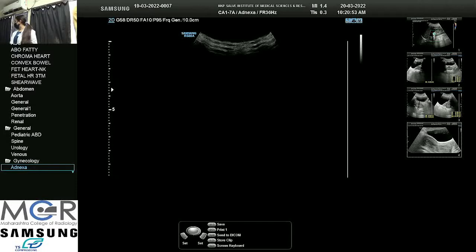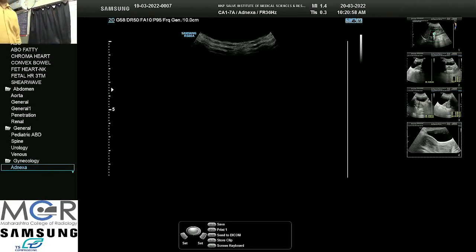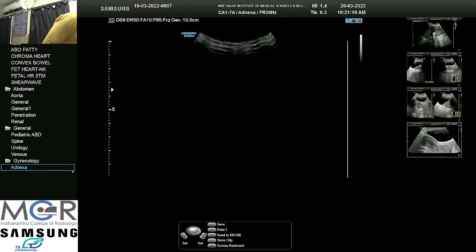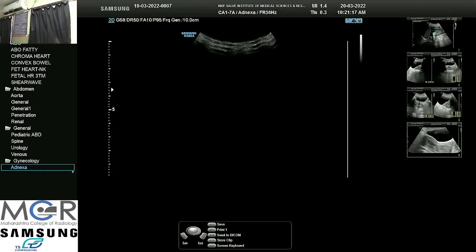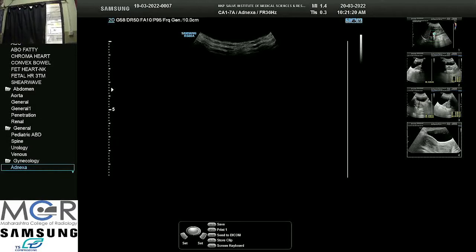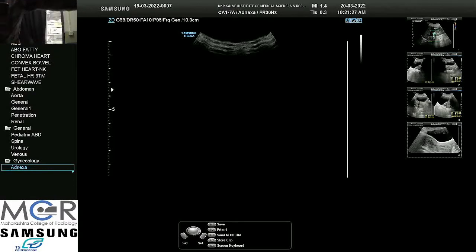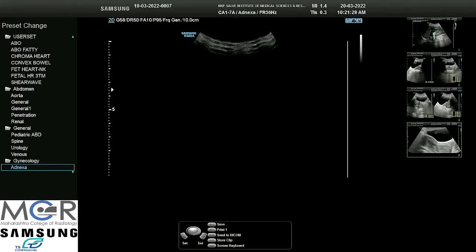First we will do a transabdominal sonography. It is very important that we understand what we are doing before we start the examination. When we take the patient on the bed, we should first make her very comfortable and ask her history — why she is here — and then start the examination. For pelvic examination, when we ask the patient to lie down, we should cover her with a nice cloth so that she feels secure, and if it is a male doctor examining her, we should ensure that there is a lady attendant or her relative present.